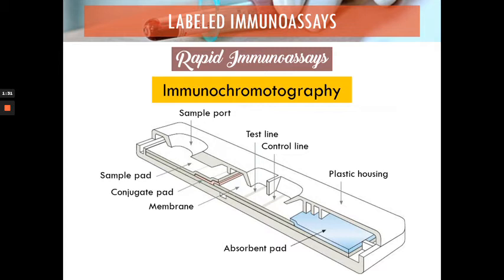Some of my students in IS were already introduced to this method in AUBF, analysis of urine and body fluids, last sem. So this is just a review, hopefully. And for the new students who are encountering pregnancy testing now, I hope you get the overall principle of how immunochromatography works.